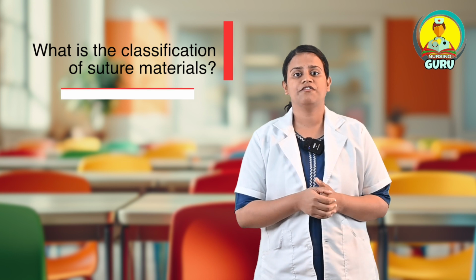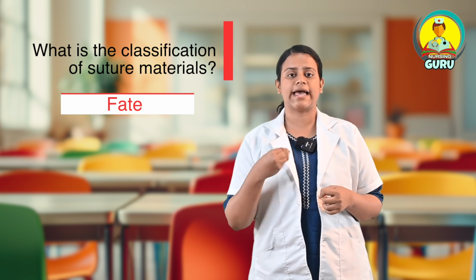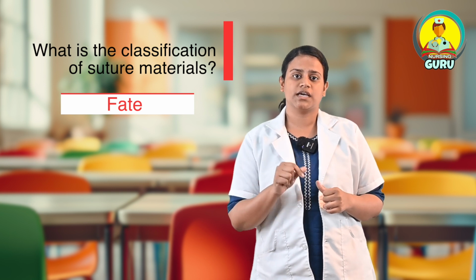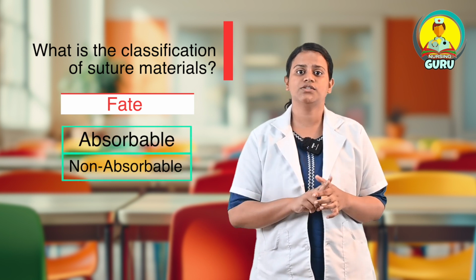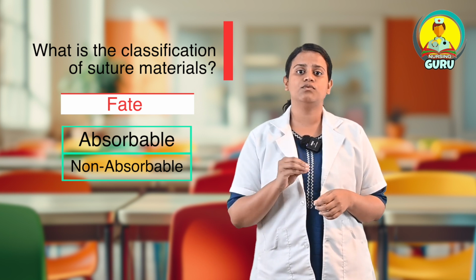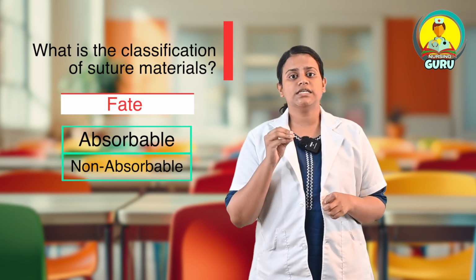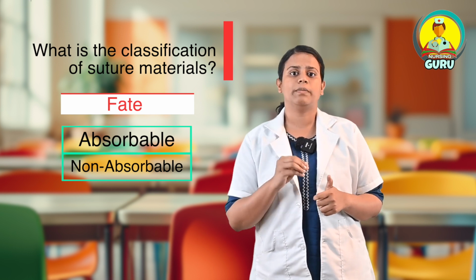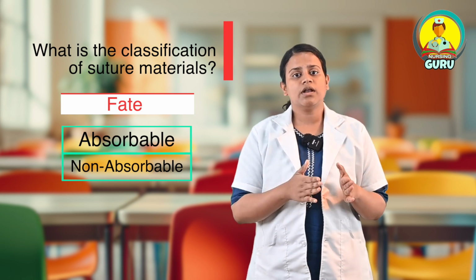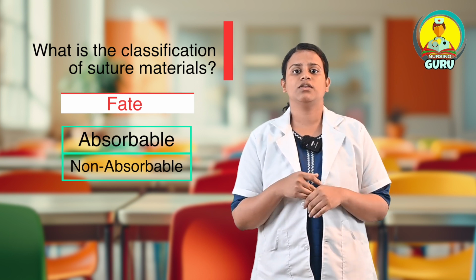Next, according to the fate. According to the fate is nothing but the development after suturing, what is the action of the suture inside the body. So according to the fate, there are 2 types again. One is absorbable, second one is non-absorbable. Absorbable sutures will be used in the deeper wounds or in the wounds which occur to the inner organs or internal organs of our body. These absorbable sutures will be absorbed by the tissues in the bloodstream and will be excreted outside of the body. Non-absorbable sutures will be used in the superficial parts of our body such as skin or in your muscle layer.